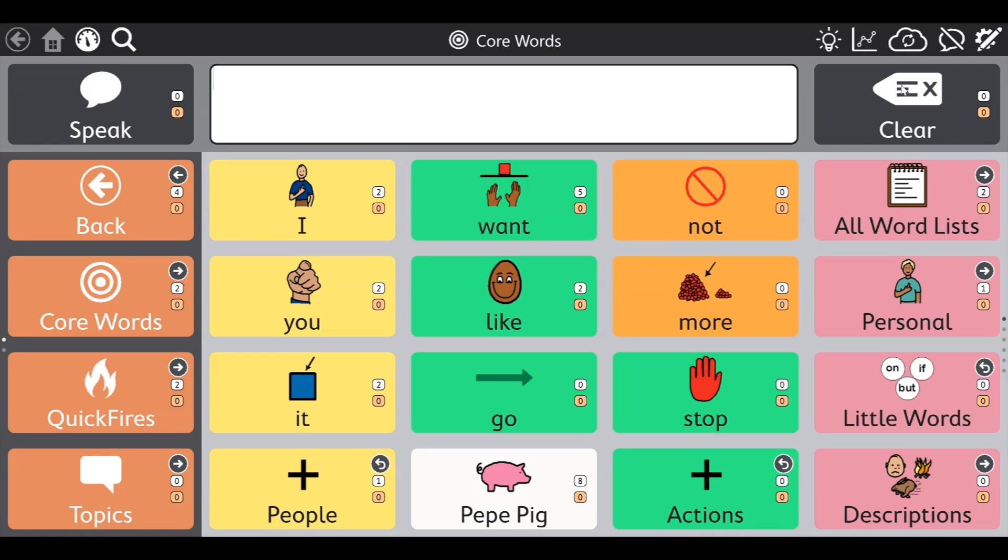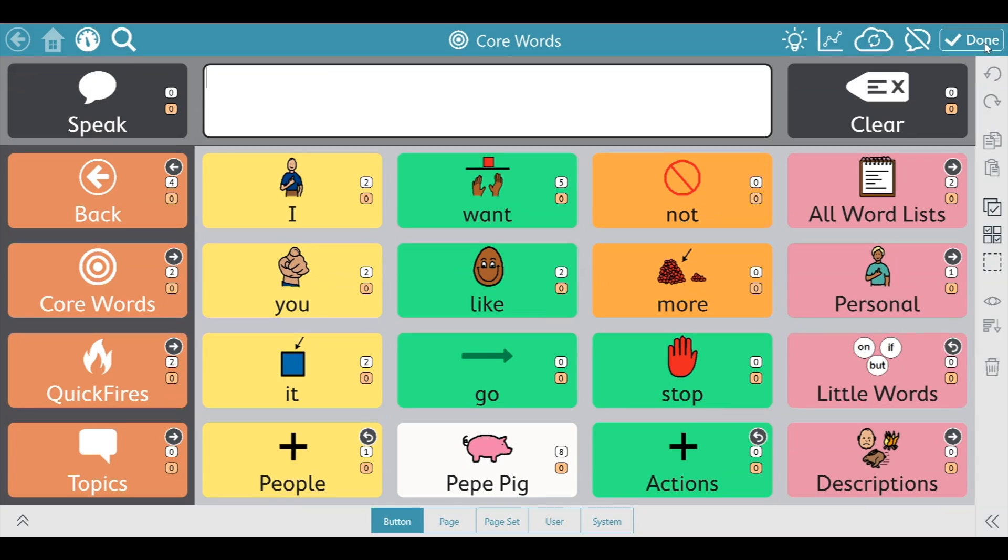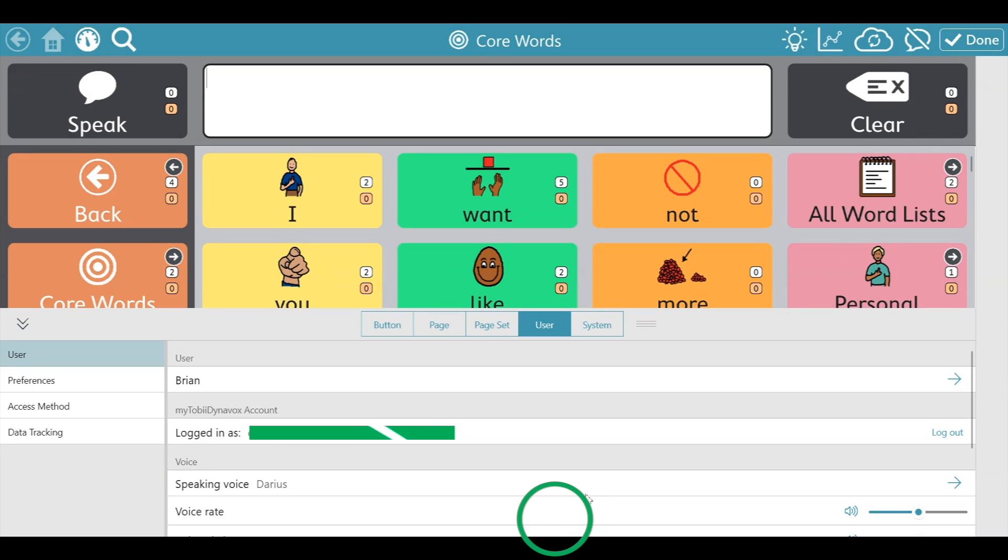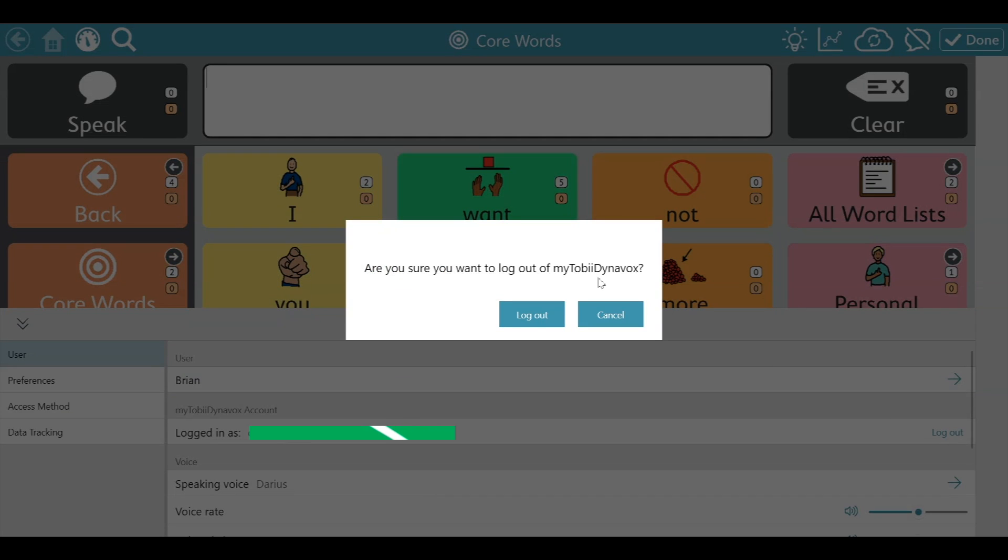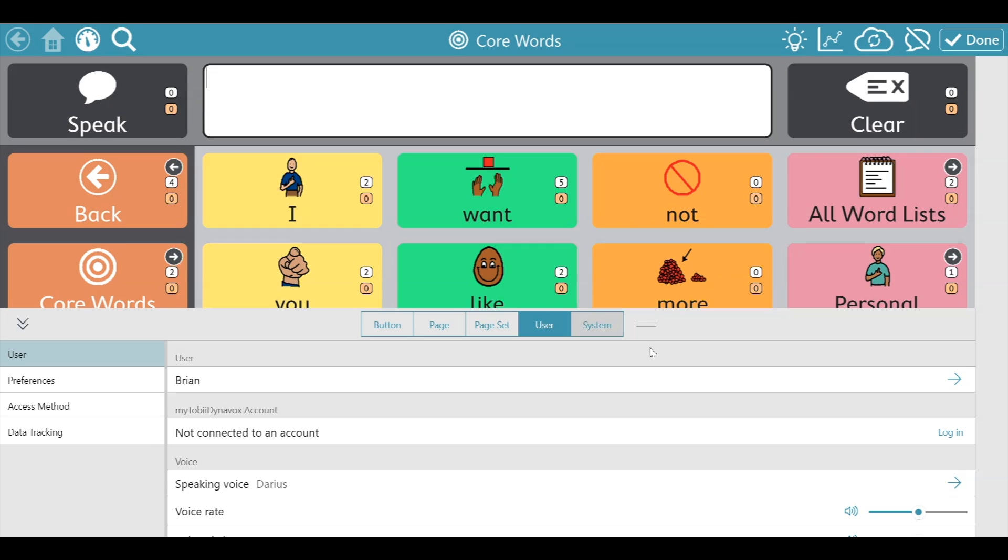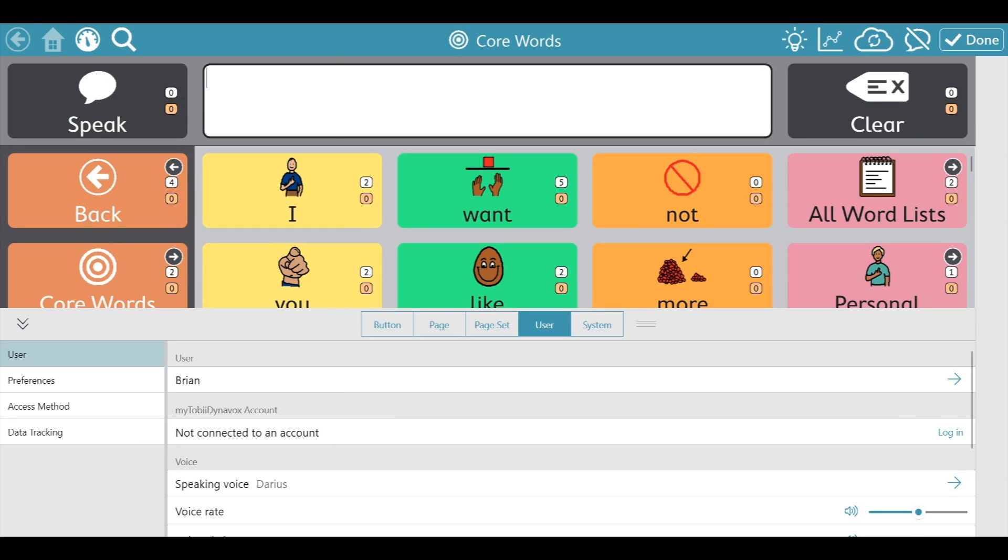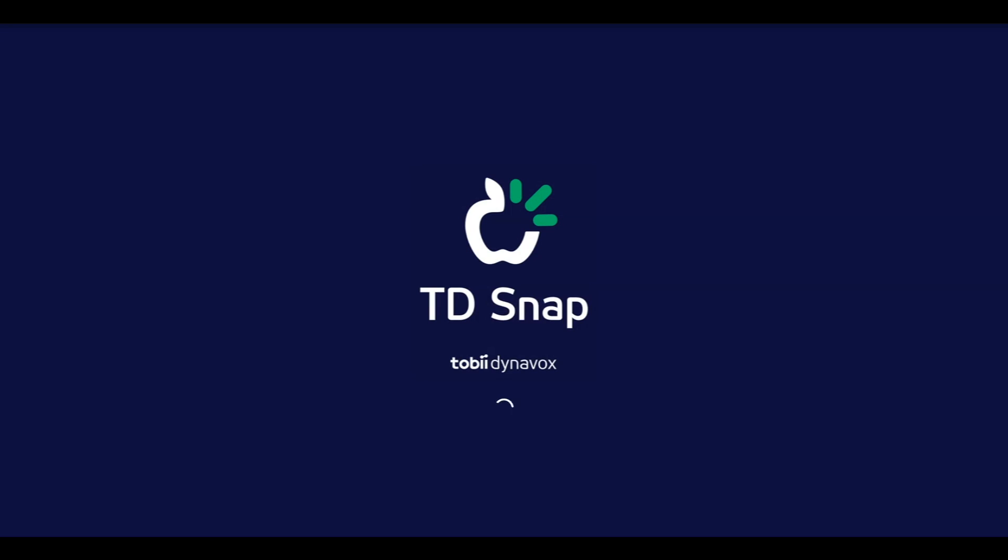Let's go back to TD Snap. Make sure we're logged out. Press log out. Here we can see that we're not connected to an account. Let's close out the application and reopen TD Snap.